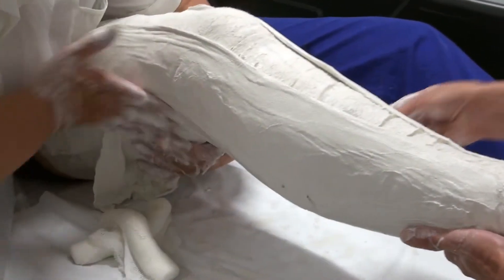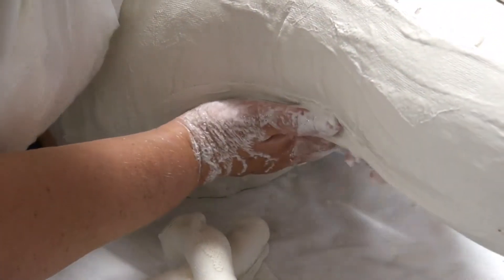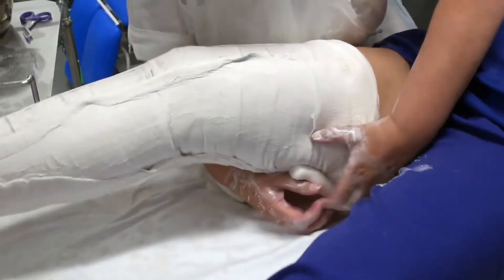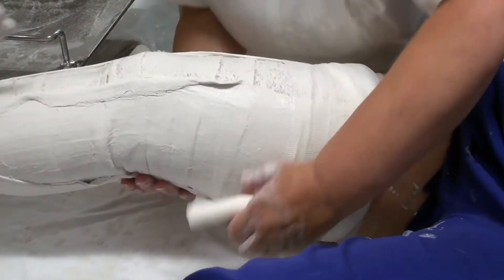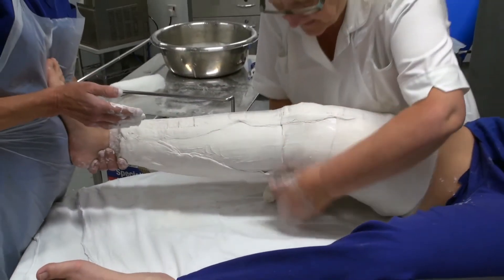I'm just now applying the back slab — keep the knee in five-degree flexion, natural flexion. Make sure the knee is nice and straight in line with the toes, keeping the foot up at ninety degrees.